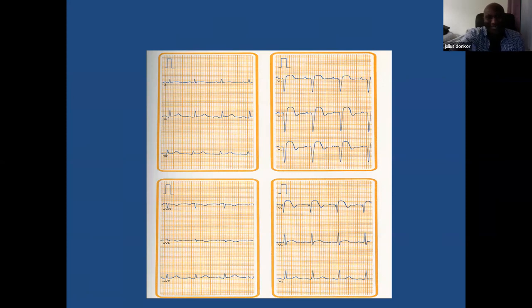Because you can see your ST elevation there. You're not wrong there. It's anteroseptal because it's from V1 to V4. But yeah, if you said anterior MI, that's fine. It's interchangeable. A lot of people use either. So it's more anteroseptal because V1 to V4 is anteroseptal MI.